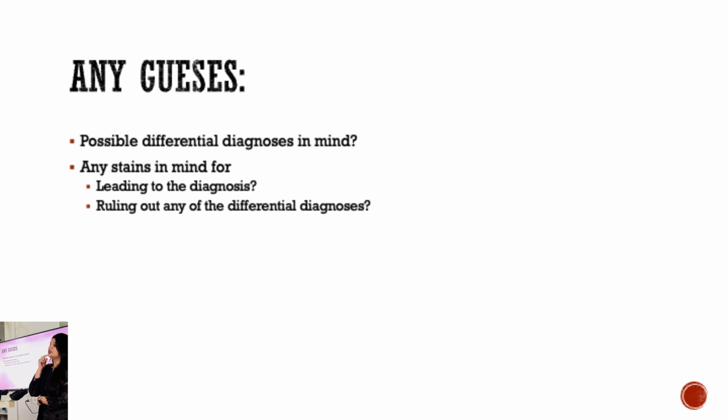It was a mandible swelling. Just think lymphoma from the small round blue cell. Yeah, that's a good thought, based on age and location.